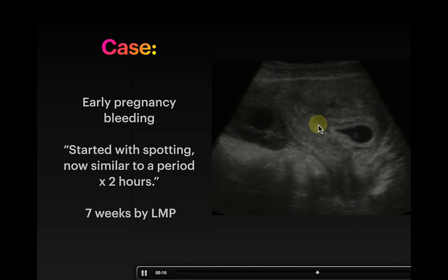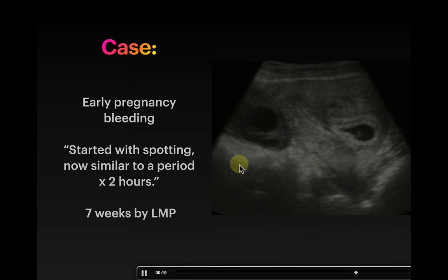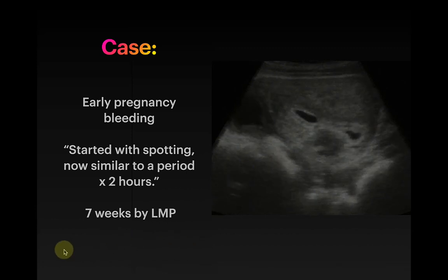These 2 are complex cysts on an ovary. And this last one is this kind of slushy stuff. What's this? It's a subchorionic hemorrhage. Do we care? No. All right, we'll congratulate her and tell her we hope things go well.